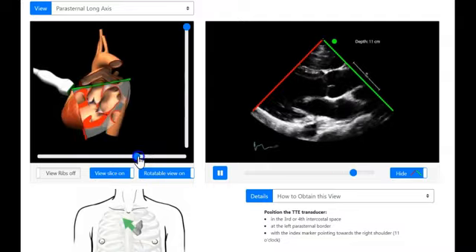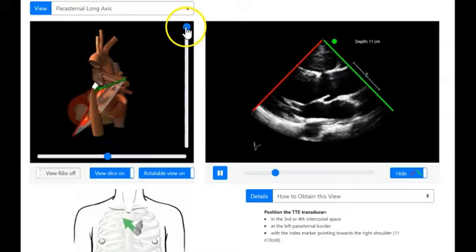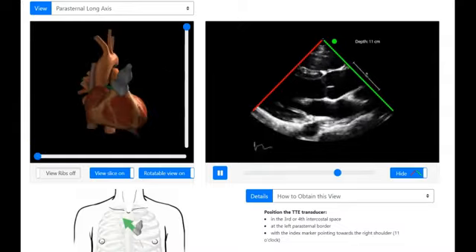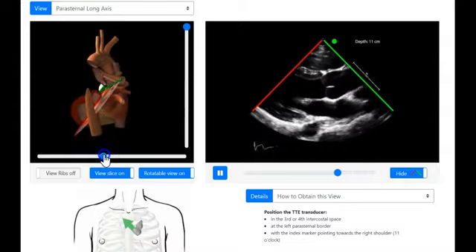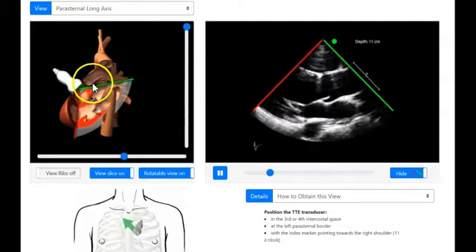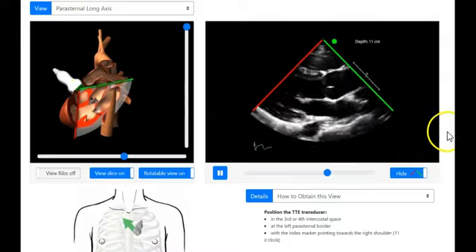And as you can see in this situation here, the left side of the heart's removed, and what's left is everything beyond that. You're looking right through the right ventricle, and so you can see up here that it peers right through the right ventricle. And you can see how the machine takes the cut and spins it around, and flips it up and turns it into this here. I know the spatial stuff can be challenging if you just follow the green line and sort of follow it up in there, like that, right?